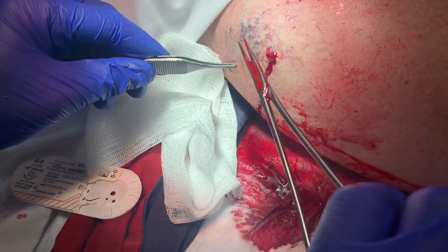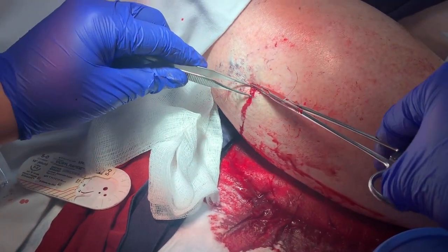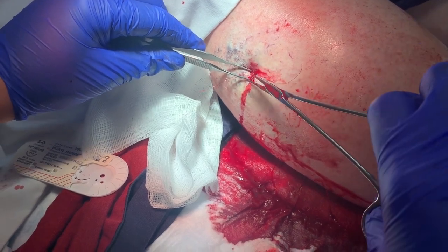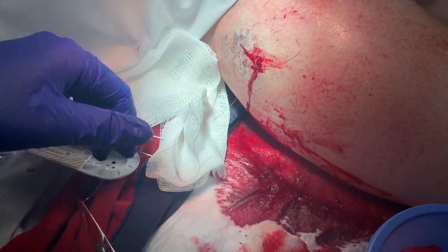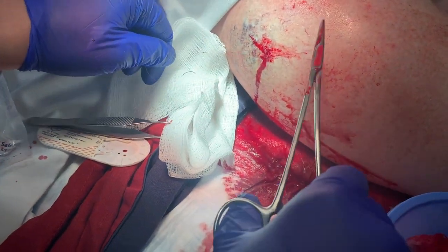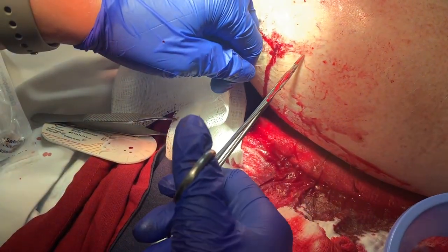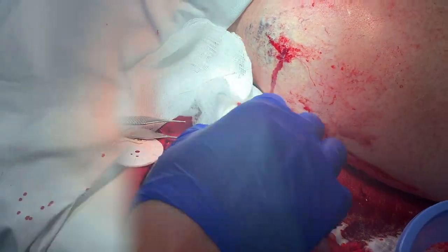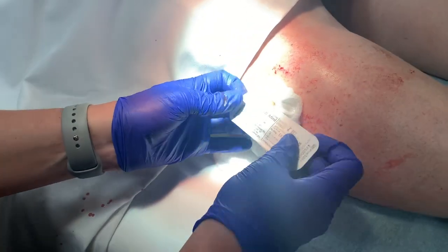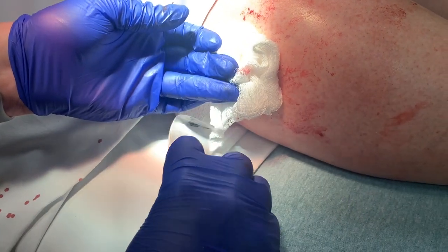We're going to go in here and finish our stitch by placing another figure-eight. Hard to see because it's bleeding everywhere. Go ahead and go in. Hopefully this one will do the trick, but you never know. So I'm just holding some last-minute pressure after two figure-eight sutures — we did that for about a minute.